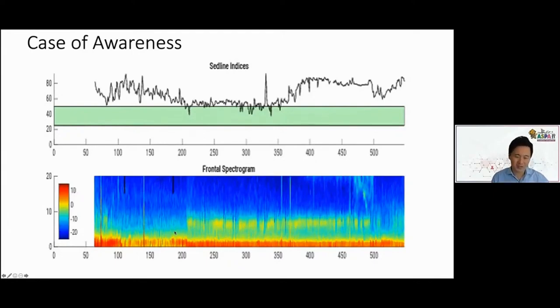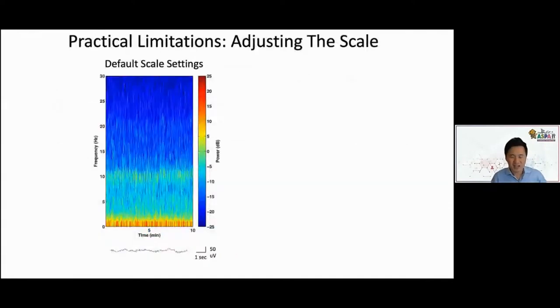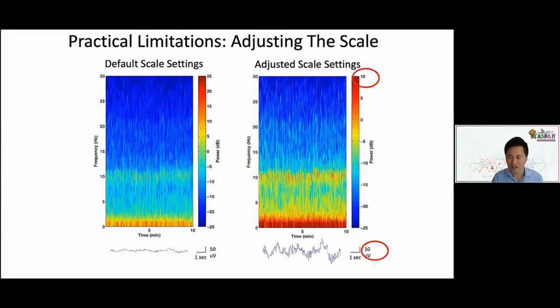And it's difficult because in this case with a patient who has liver failure, who's older, that alpha oscillation is really small, and the overall EEG is really super small too. So to deal with this in these very sick patients, and you may encounter a very sick pediatric patient as well, the thing to do with a small EEG is to change the scale, adjust the scale so you can see the key features that you need to see in the spectrogram and in the waveform. So slow, alpha, and waveform. Really key for the very sick patients to change that scale and be very careful so that you don't miss the key features and then inadvertently under sedate them.